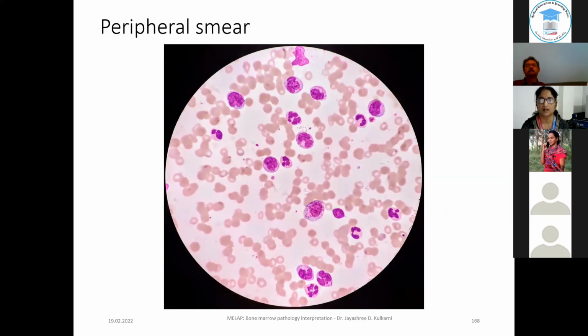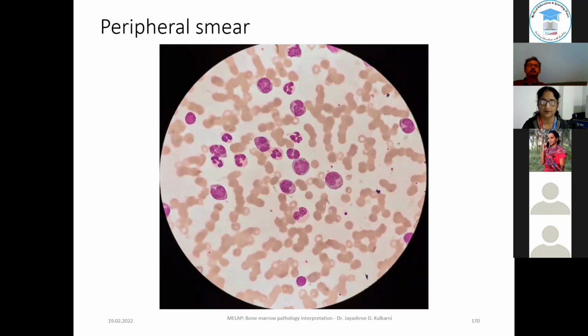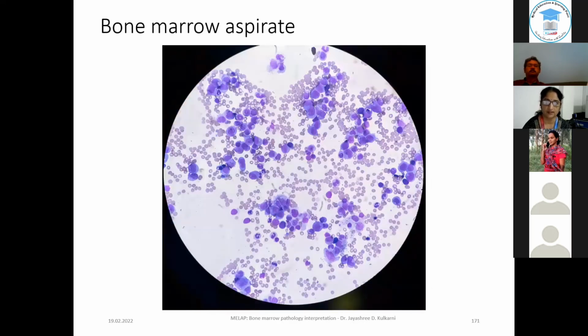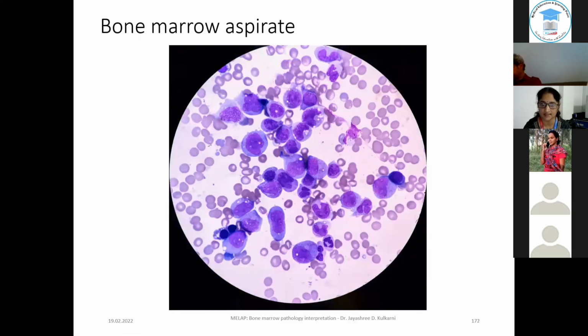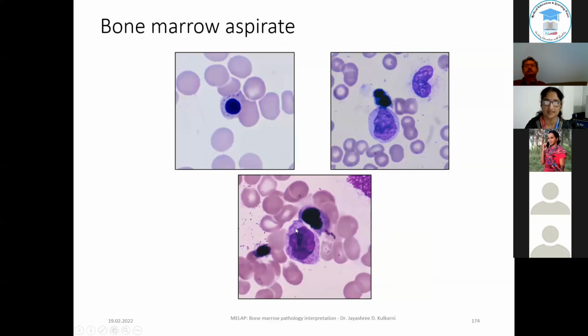There is nuclear abnormality in the lobation. You don't see much of cytoplasmic vacuoles. They are showing some granules. So these look like abnormal monocytes. Not much shift to the left. In the bone marrow, again, you see some cytoplasmic vacuolations and predominantly the monocytoid series, but really cannot appreciate many blasts here. So on the differential count, you look at the lacy chromatin of the promonocytes and monoblasts. It's not as dense as the myeloid.